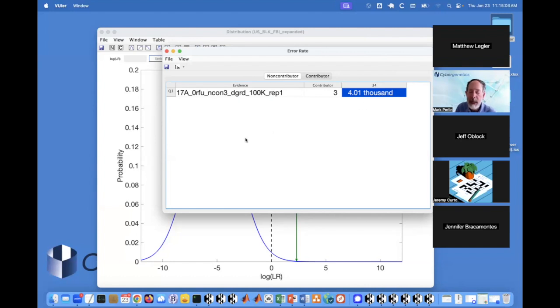So you can see it as a fraction, but most people, including juries and lawyers, would understand a number like 1 in 4,000 more readily than a fraction. So we usually report it that way. People who study communicating statistics to non-mathematicians recommend using whole numbers.